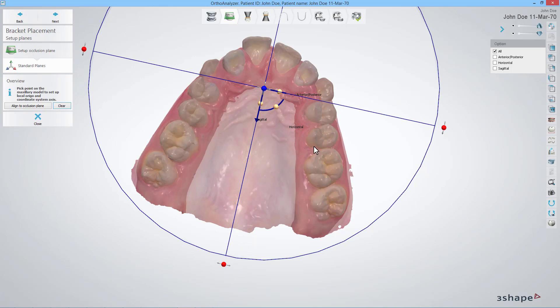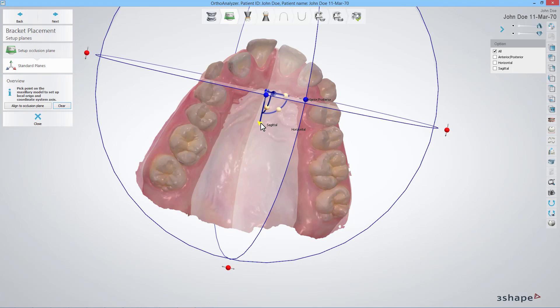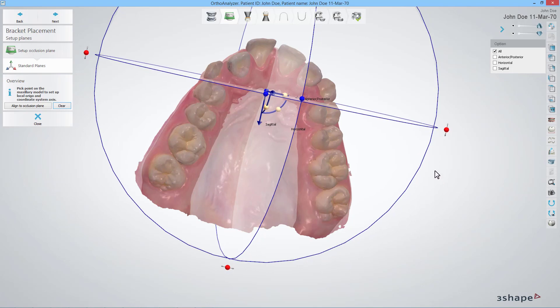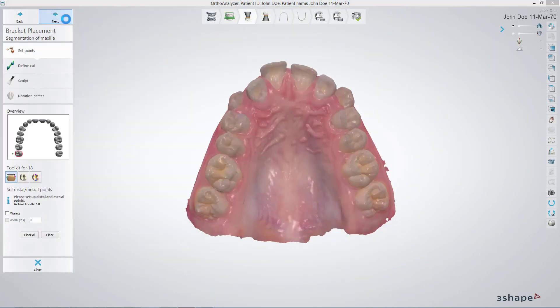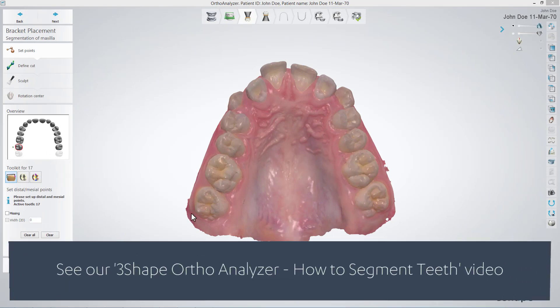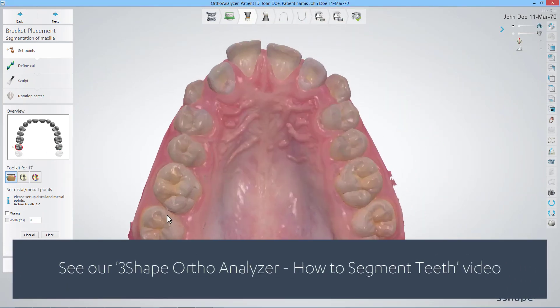Please remember, in order to move and rotate axes in 3D space, we recommend using the blue arrows and/or red control points to change the specific axis without changing the other ones. Before putting the brackets on, the model has to be segmented. For details on how to do that, please watch our video.